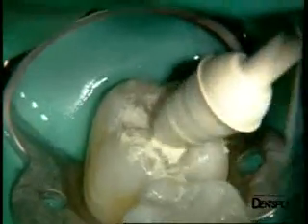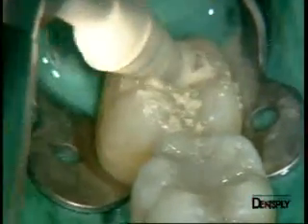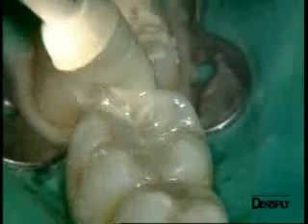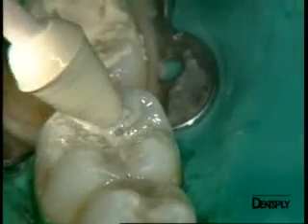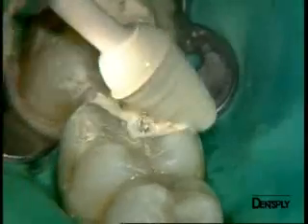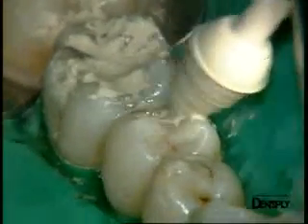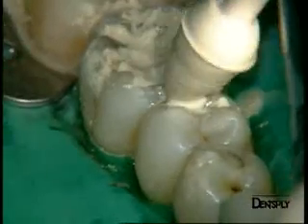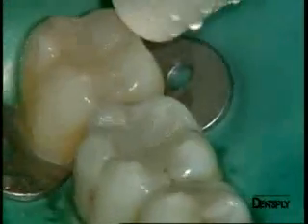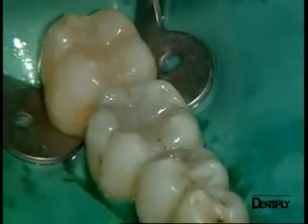The finishing stage is completed very quickly using only one instrument — the .4 from the POGO system. It gives a very nice shine on the occlusal surface, having beforehand used the red ring finishing burr. We can work, as is the case here, without a spray on a lightly moist tooth. We work at low speed to avoid the risk of overheating. It is possible to use it at low speed on a dry composite too. We want to make sure all dental surfaces are polished with care. The quality of the result you can see on screen is obtained with only one single instrument.